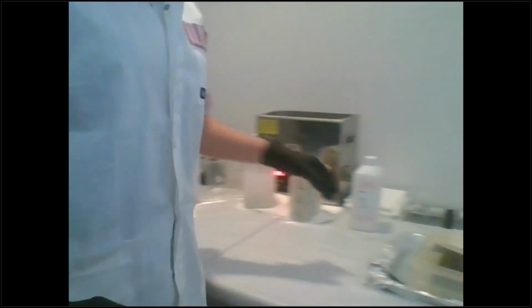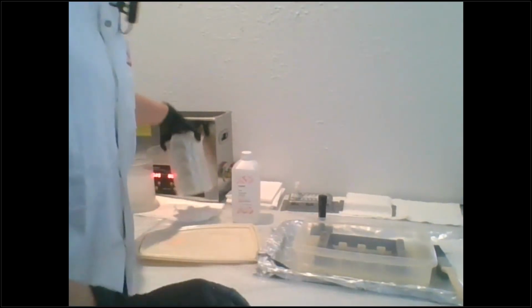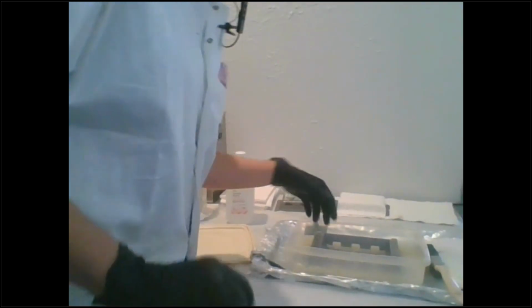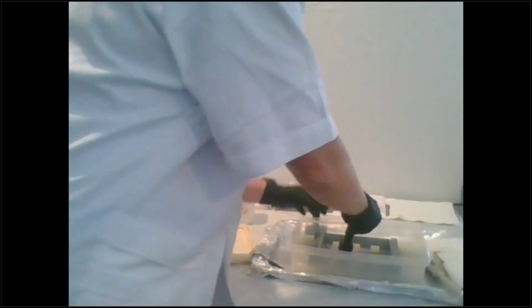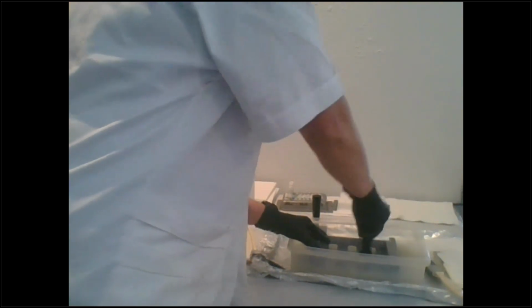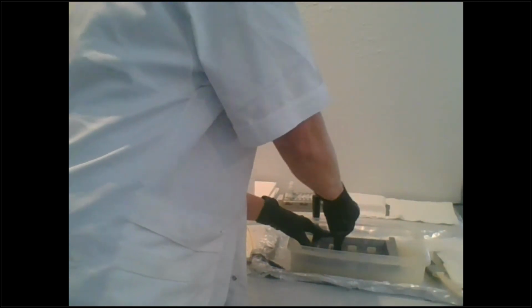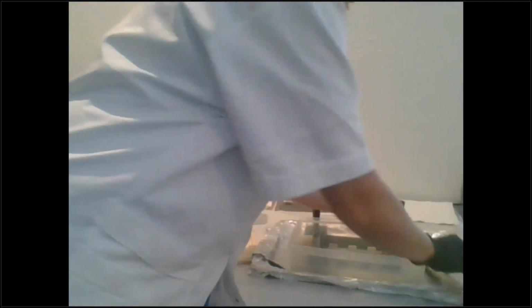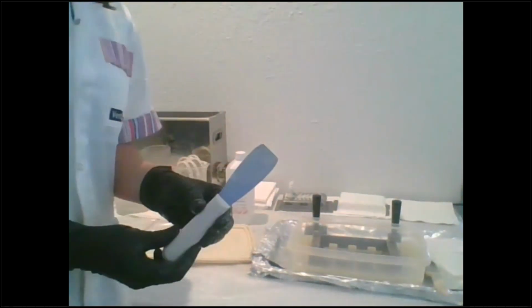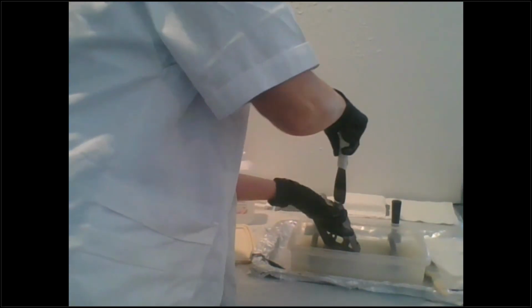Now, when you go to clean your build platform, within just a couple of minutes, right when I'm waiting for my parts to be in the ultrasonic, I just use my punch tool, and I'll go through and do my punch, okay? And this punch tool came in your accessory kit. Then you're going to use this other tool that came in your accessory kit, this scraper, okay? And you'll just get the remaining parts off of there.